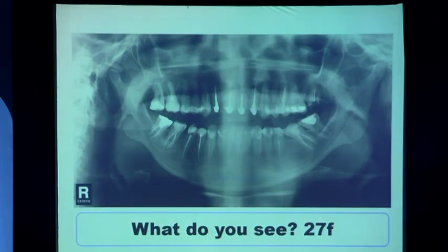A 27-year-old female comes to us with the feeling of something stuck in the throat or something constantly poking in her throat. You saw the normal OPGs, right? See, mind you, this is not a pathology. This is just a variation in the anatomy. Okay, when we say variation in anatomy, it can be either an anatomical variance or variation in anatomy. It's debatable.